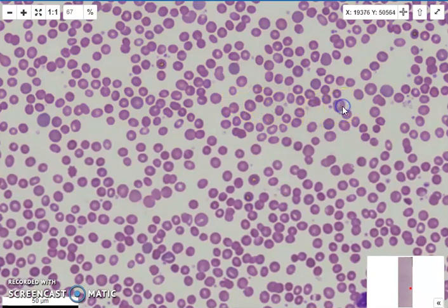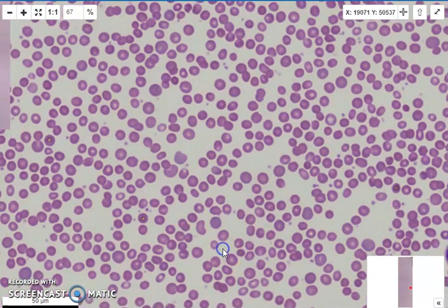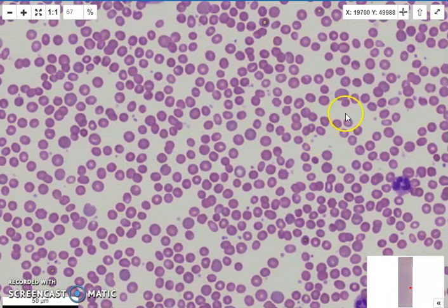So they're our reticulocytes, and we say they exhibit polychromasia. And these are these larger blue cells here. Now I know you at home are thinking, Rebecca, they are the same color as the other cells, and I promise you they are not. And hopefully by the end of this course you can appreciate that your reticulocytes exhibit polychromasia and they are a slightly blue color.